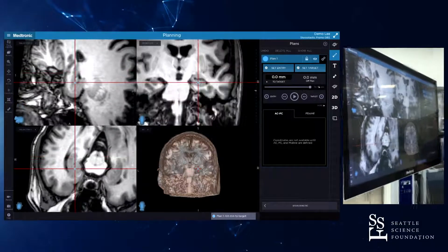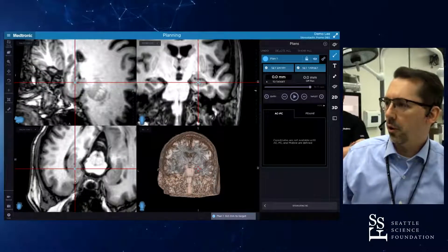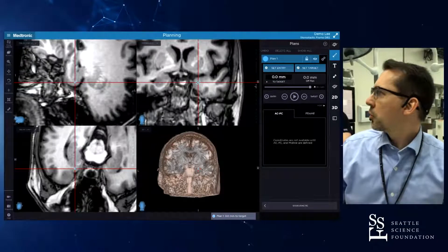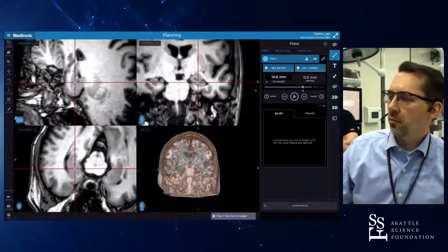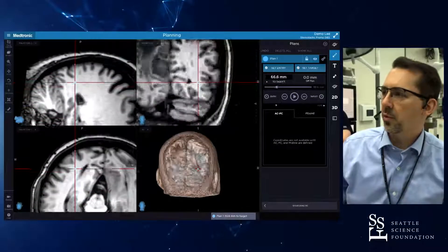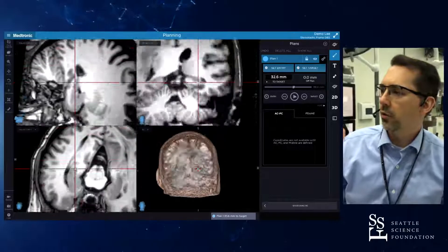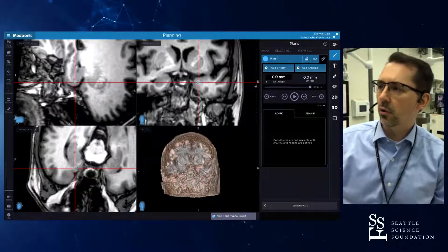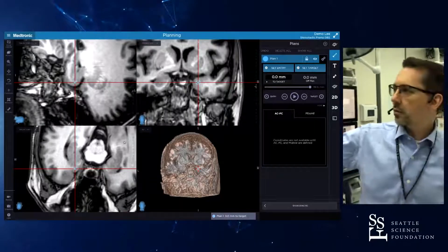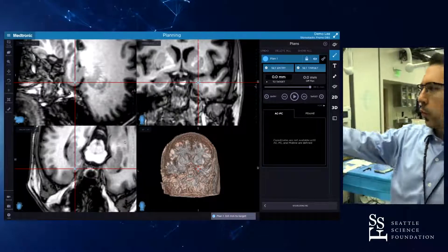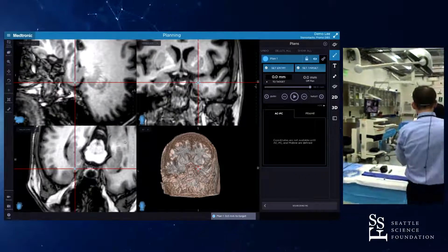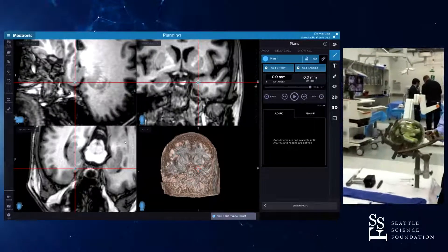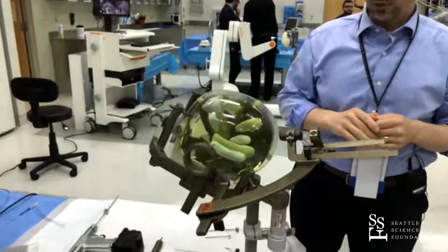If I ablate from here forward, I'll have obtained all the targeting of the amygdala and hippocampus that I need. We start with a trajectory that takes us through the ideal path through the amygdala hippocampus, then carry it out all the way to the surface entry point and to the target, which goes through the amygdala and into the entorhinal cortex of the medial temporal lobe. This gives us the actual frame coordinates that we put into the Lexel frame, very similar to what Dr. Ponce just showed you for DBS.